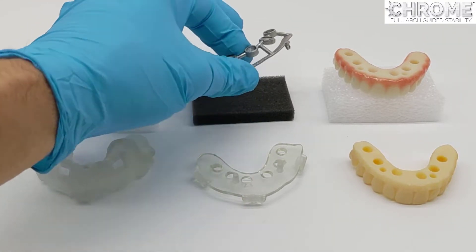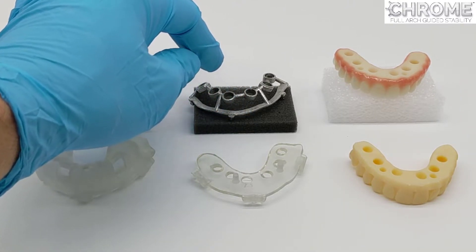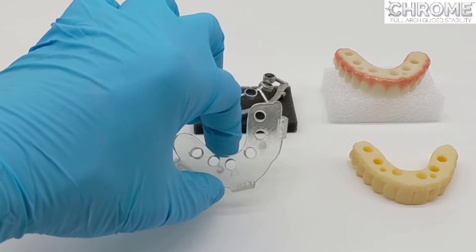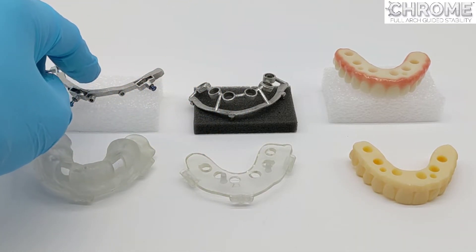The osteotomy guide is used to create the osteotomies, but also to deliver the implants. On many systems, the carrier guide is used for a few functions: one is to test that enough bone reduction was completed, and the other is to support the rapid appliance and the long-term prosthetic.